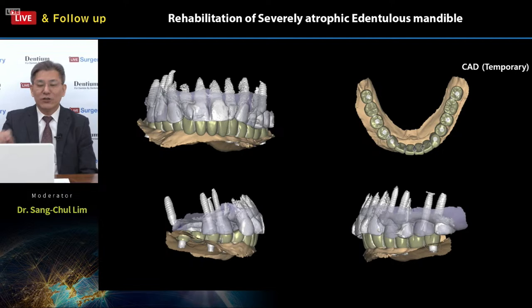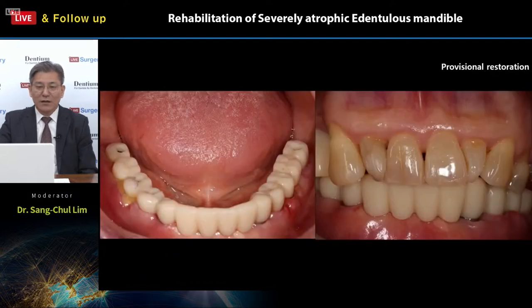So we can use this kind of information to make the final restoration and the final situation. Okay, this one is an intraoral view, delivered with the PMMA temporization on the lower part, the provisional restoration.